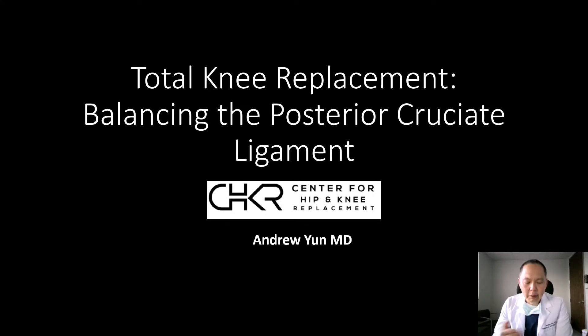Traditionally, prior to the advent of robotics, we would balance the PCL during knee replacement using a combination of rulers and blocks. This was essentially done by feel and by eyeball — a very qualitative method of achieving balance. With the advent of robotic and computer-assisted systems, we now have a very quantitative method of balancing the PCL, and in this video we're going to take you through that process of using technology to create a symmetric and rectangular flexion gap.